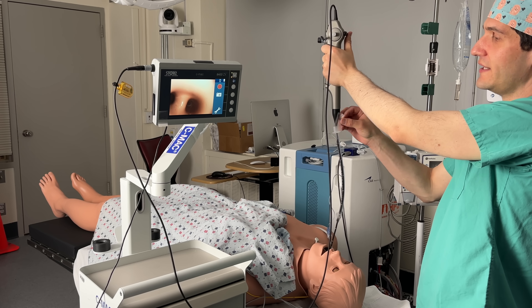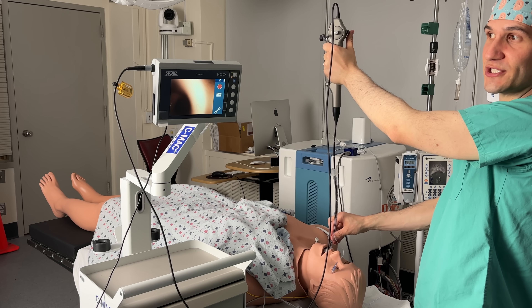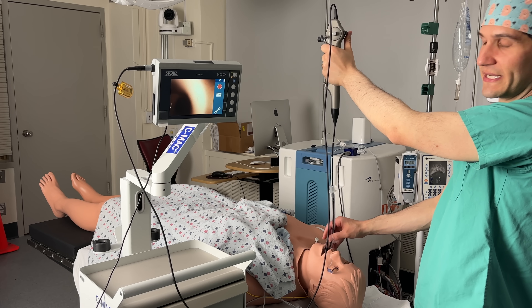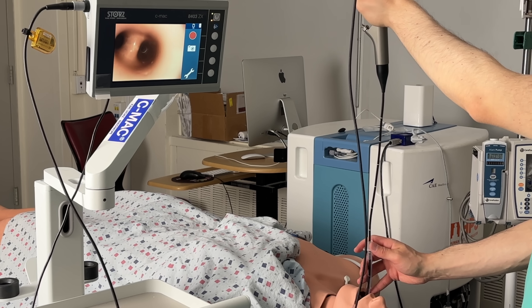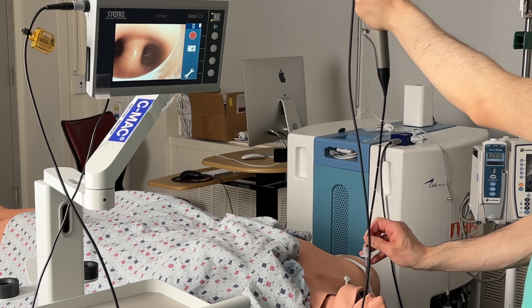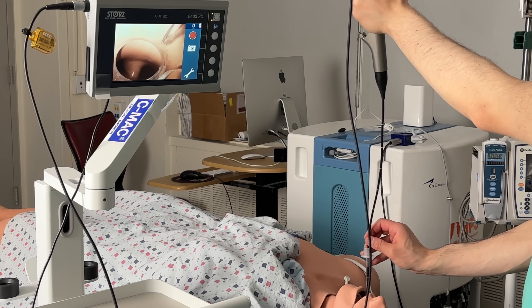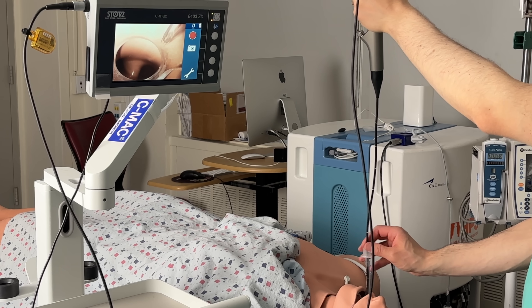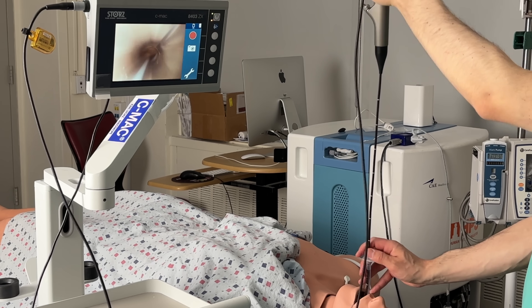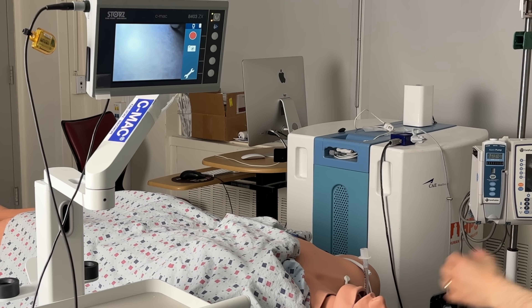I'll go ahead and untape my endotracheal tube, slide it gently into the patient's mouth while keeping this view on my screen. With the carina in view, I slide the endotracheal tube down the tip of the scope until I can see both the tip of the tube and the carina, assuring me that I'm in exactly the right position. At that point I can go ahead and remove my fiber optic scope and connect the patient to the ventilator.